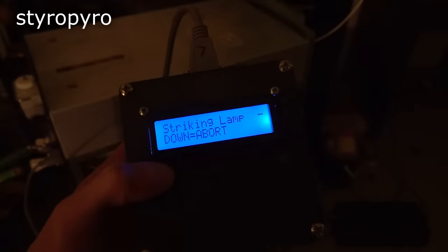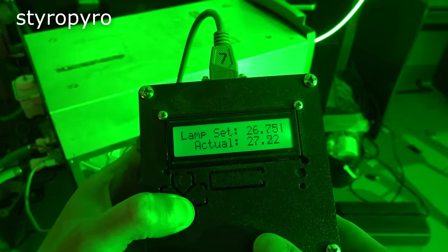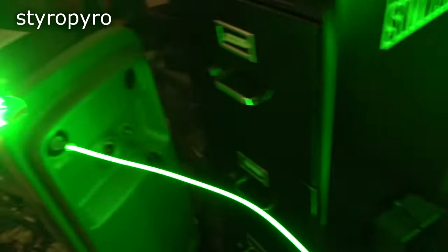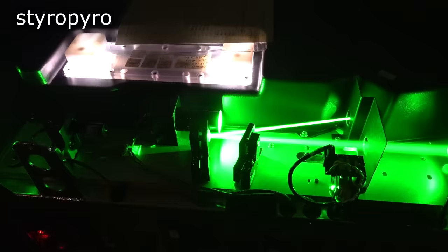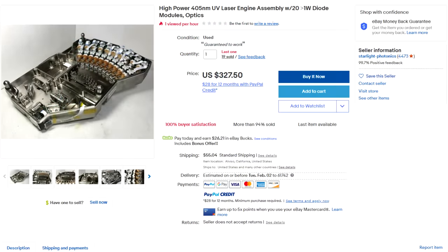I can adjust a bunch of parameters like lamp current and Q-switch rate, as well as monitor the water temperature and pressure. His board plus the surgical laser gives an unbelievably low-cost way of attaining a 100-watt green laser system. I don't usually recommend eBay sellers, but this is an exception — I've bought from Starlight Photonics for many years and have gotten a lot of cool parts for my projects from them.